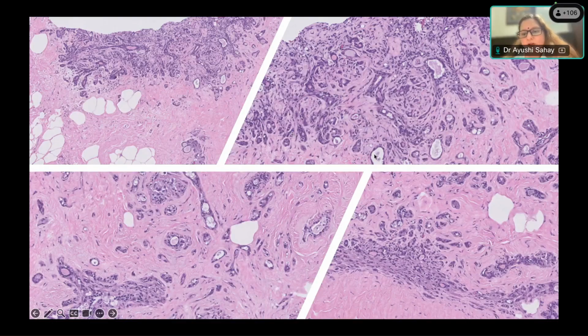And then you are having this kind of pink cells. What kind of cell do you think these are? The cells with abundant pink cytoplasm flowing here and there. If you were somewhere in the GIT, what would you think these cells to be? Smooth muscle cells, wouldn't you? So some kind of myoid cells, okay? You are seeing some kind of myoid cells at the periphery of these compressed ductal epithelial structures, which are of varying sizes, varying caliber, angulated, but still arranged in a lobulated manner in one aggregate. And you are seeing some kind of larger duct which is branching into smaller ducts. Can you make out these larger ducts that are branching into smaller ducts?